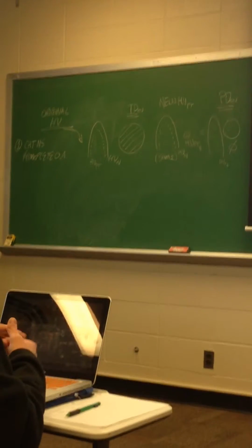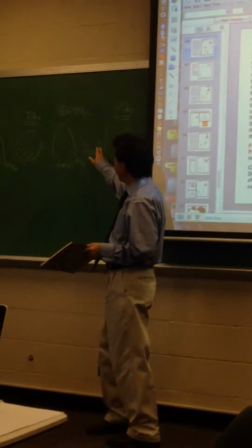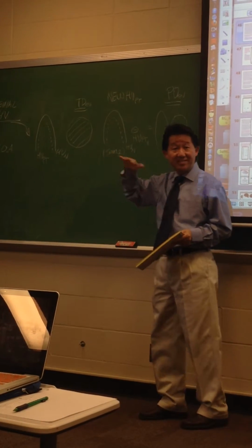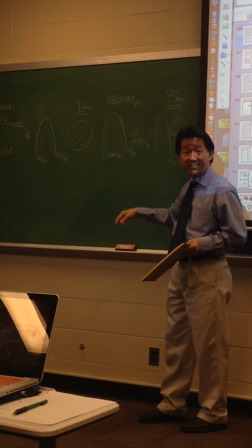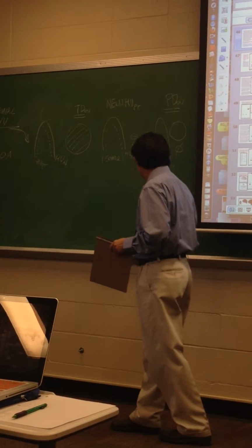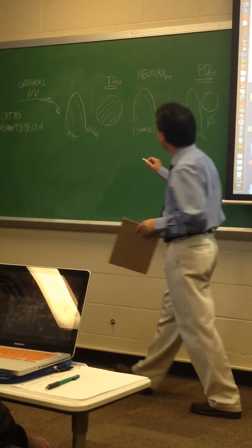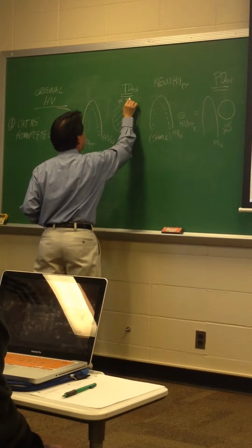Okay. So the pattern deviation just compares the patient to the normal value? Okay, so what the pattern deviation does is it calculates the mean sensitivity and then just gets rid of it, and then it runs through that comparison of stats again. So here, this would be versus stats, right?